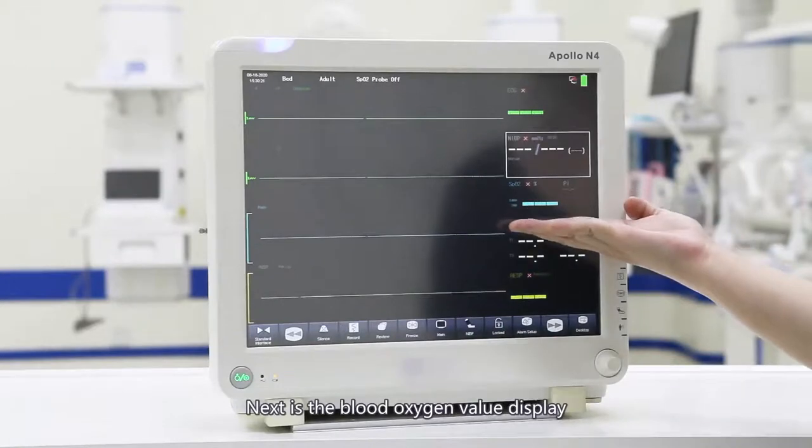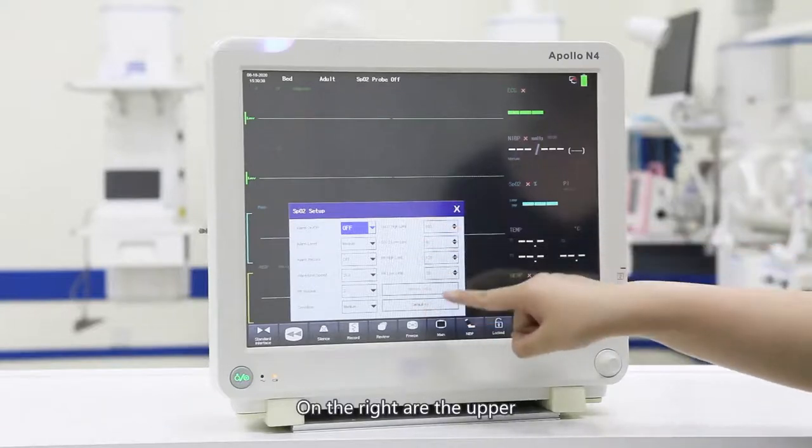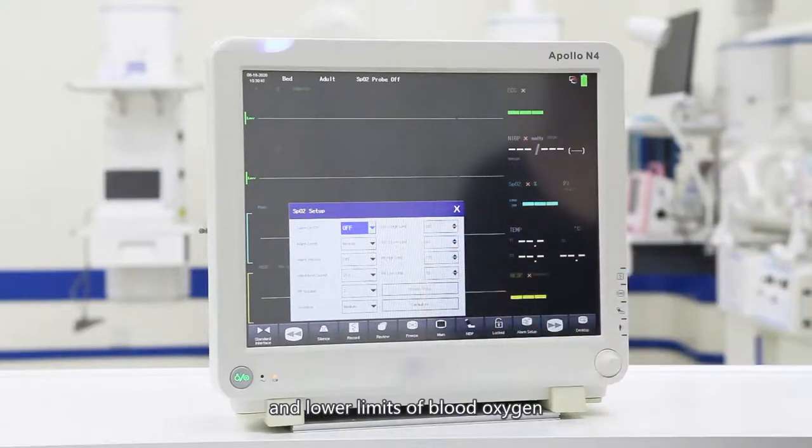Next is the blood oxygen value display. After you click to enter the blood oxygen setting interface, you can set the alarm switch settings, alarm level settings, alarm records, waveform speed and pulse volume, and measurement sensitivity, all of which can be adjusted. On the right are the upper and lower limits of blood oxygen and pulse rate alarms.